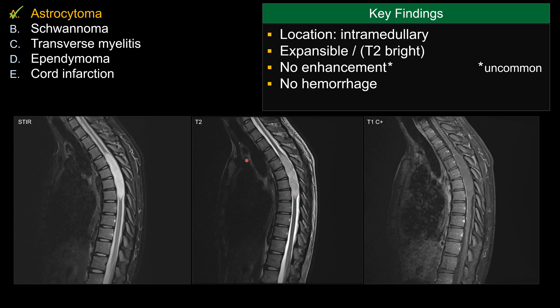There is no evidence of hemorrhage, so there's no hypointensity on T2-weighted sequence. If I see hemorrhage, I would favor ependymoma over astrocytoma. Another small clue: this is a 20-year-old, so a younger or pediatric patient favors astrocytoma, whereas ependymoma tends to occur in older adults.